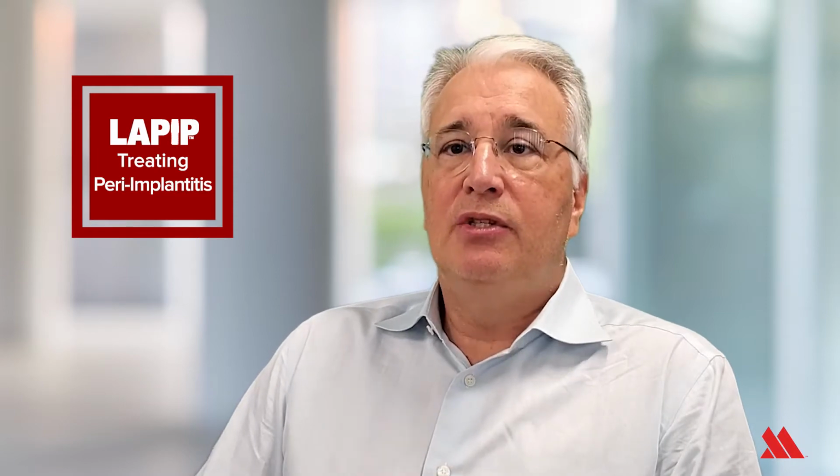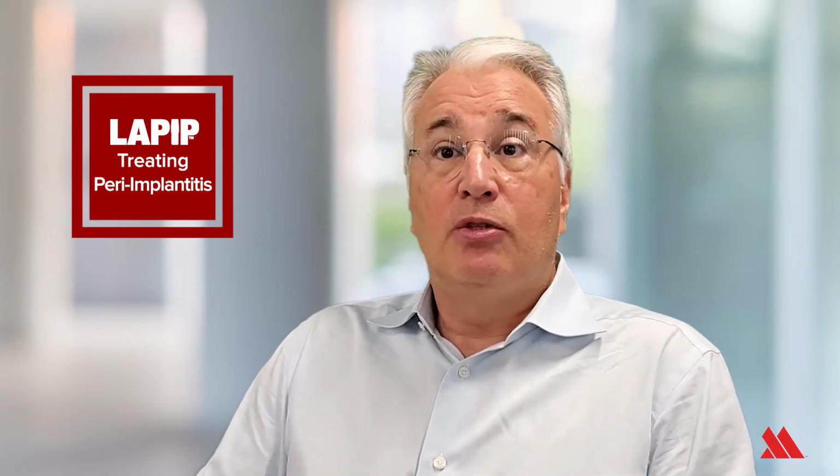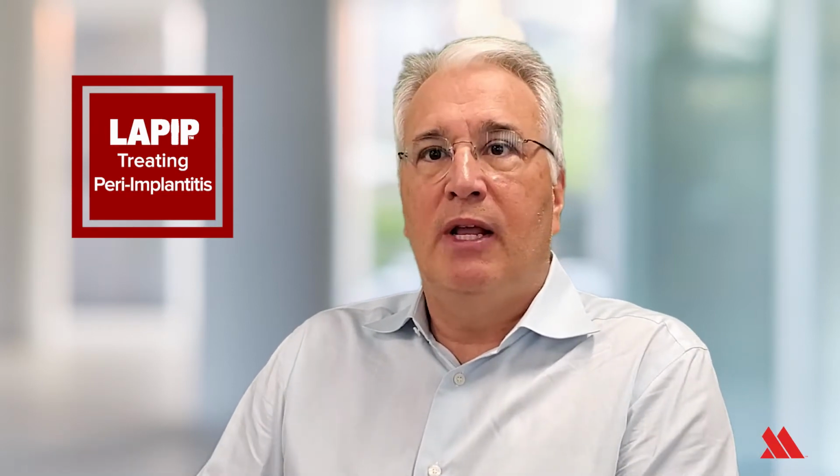But what I'm prepared to teach them, and what our team of teachers is prepared to educate them in, is what is the proximal cause, or what are the proximal causes in a particular patient. So before they ever pick up a perio laser, they're going to back up and say, why is this implant failing? Before I ever turn that machine on and put my goggles on, what is the cause of it? Because I want this to work. Because if you can't identify the cause, you might as well not start. If you don't have a diagnosis, you might as well not start treating a patient. You need a diagnosis to do that.